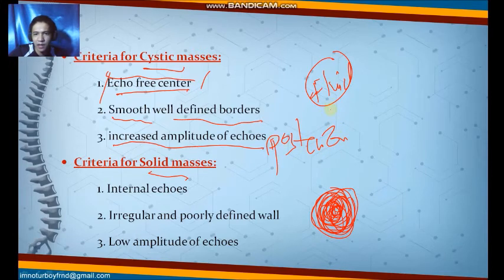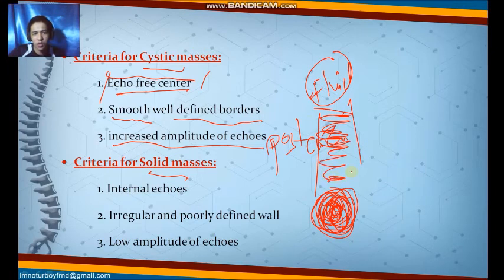You notice that with fluid, what most commonly happens is the production of acoustic enhancement. The posterior portion becomes very white because of the transmission of the ultrasound beam.